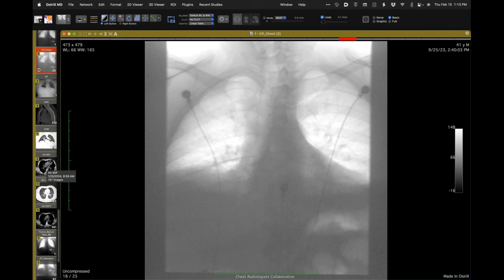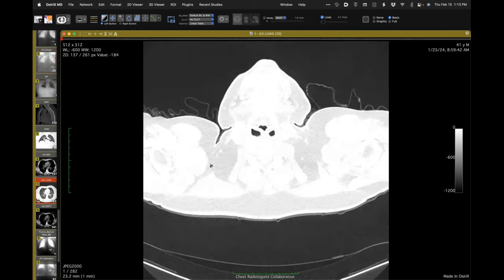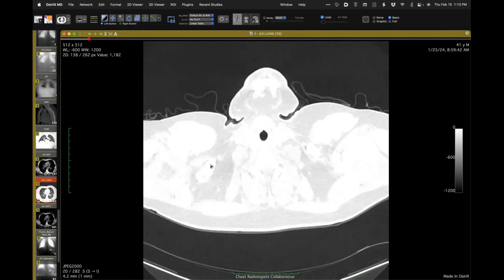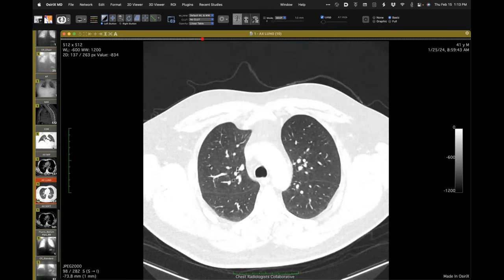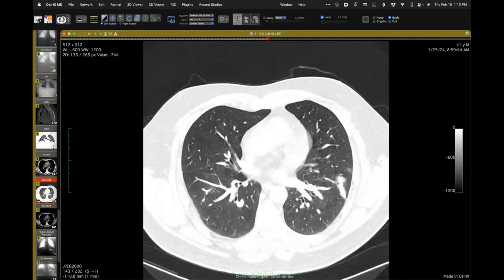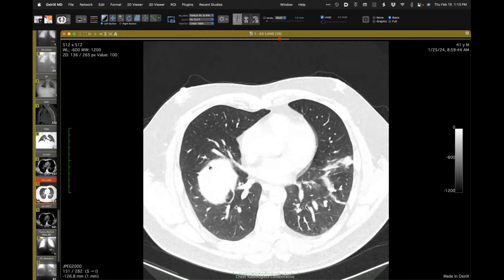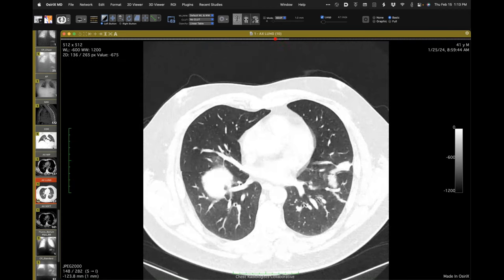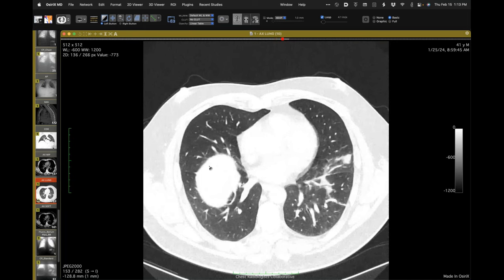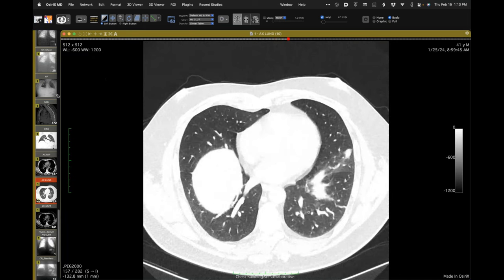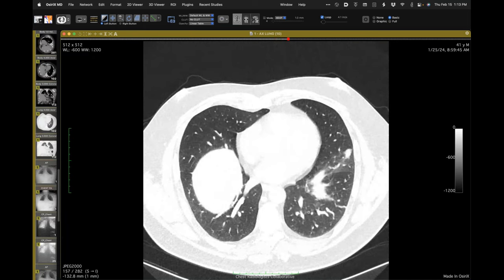On a CT from January — the procedure was done in September — we do have better inflation of the lungs. There are still foci of subsegmental atelectasis, but much better inflation compared to before.